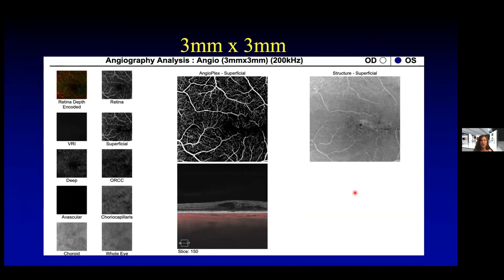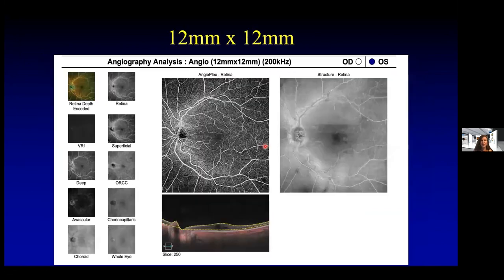Here's another patient in line with my current screening protocol for diabetic retinopathy. I do a three by three millimeter scan to evaluate the fovea for macular edema, looking at the superficial plexus. Then I do a wider scan — either a 12 by 12 or a 15 by 15 — to look at the peripheral retina for any signs of capillary dropout or retinal neovascularization.